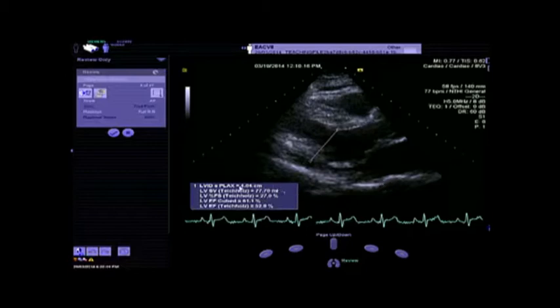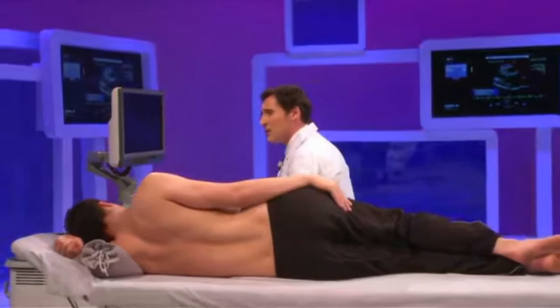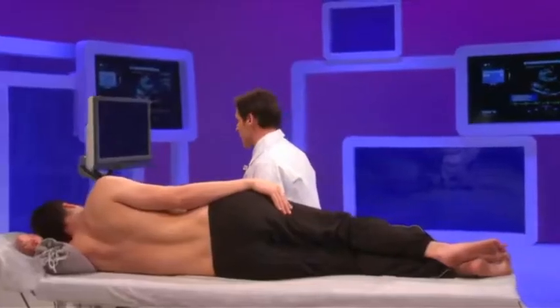And you know here we have 40 millimeters. So this means that in practice, we have a cutoff value that is close to what the American guidelines suggest as a criterion to be maybe referred for mitral valve repair, when there is a possibility of repair that is almost 90%, which is not the case in these patients. So what we have here is a value that is less than 45 millimeters, which is the cutoff value suggested by the European guidelines. So this means that according to the European guidelines, we can still follow these patients just clinically and echocardiographically every 6 months.